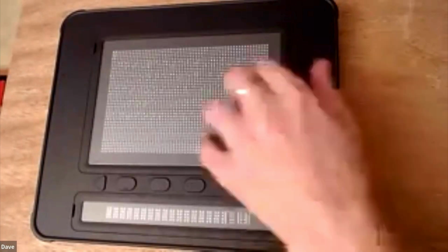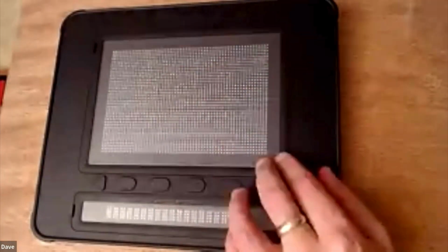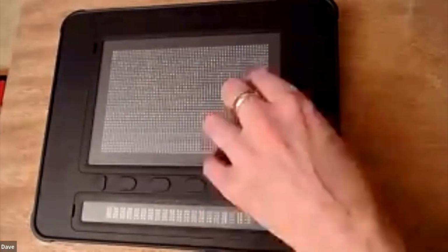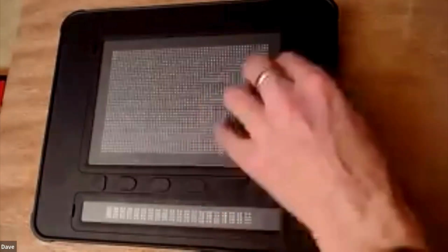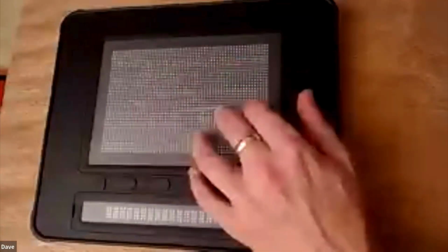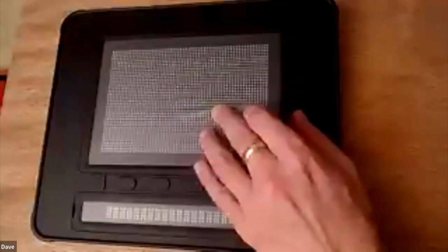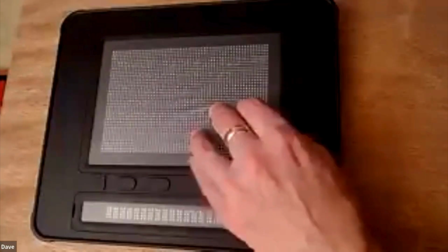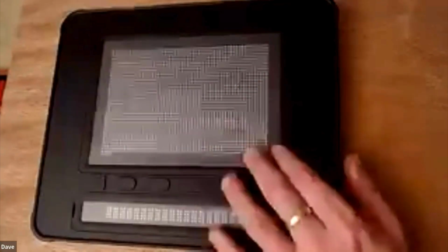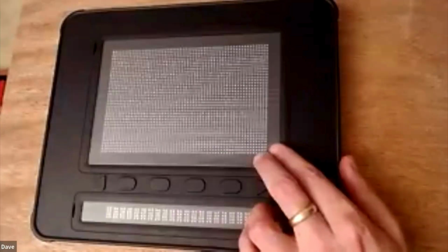And also, the other thing you notice when you use DotPad for the very first time is that we have a thin, flexible sheet that stretches over the cells. We call this our cell protector, and it prevents dust and dirt and moisture and grease and anything like that from ingressing into the cells, and it helps to keep DotPad super reliable for many years to come.